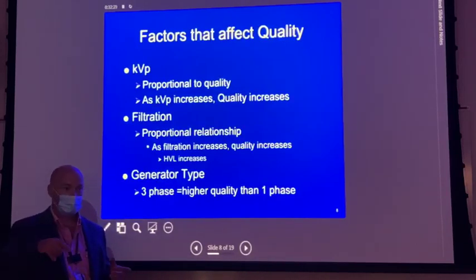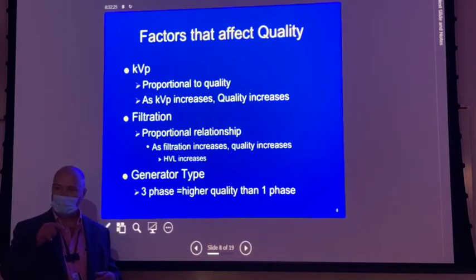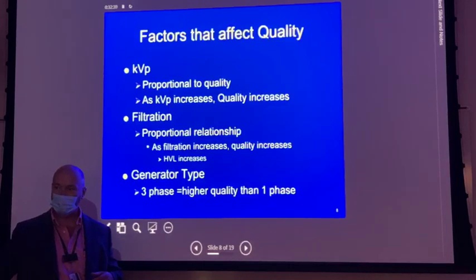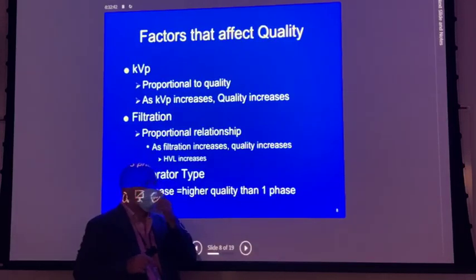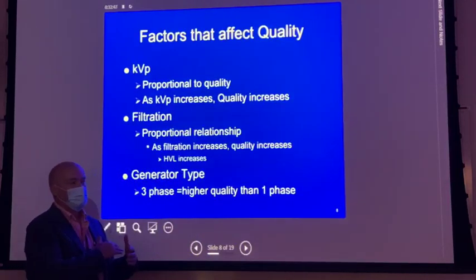You don't want to spin it very fast, but if you spin it kind of slow and then make your exposure, you'll see that for every pulse in the incoming line waveform, you'll make an exposure and have a dot on your image, as opposed to where it stops, there is nothing. So individual little bitty dots. That's single phase. When you go to three phase, you get none of those dots. It's a solid line.